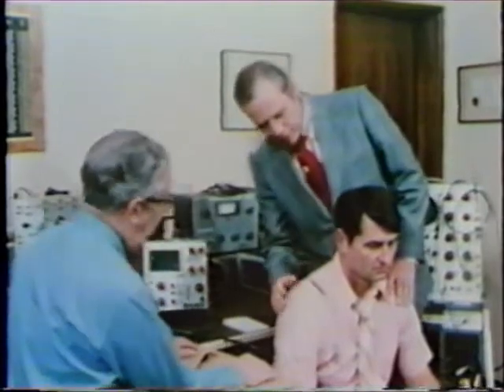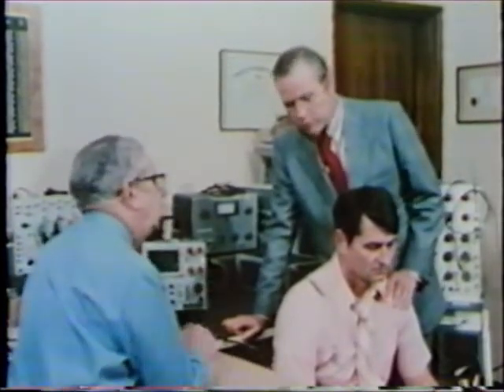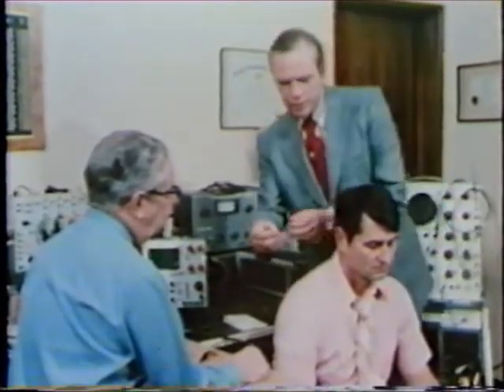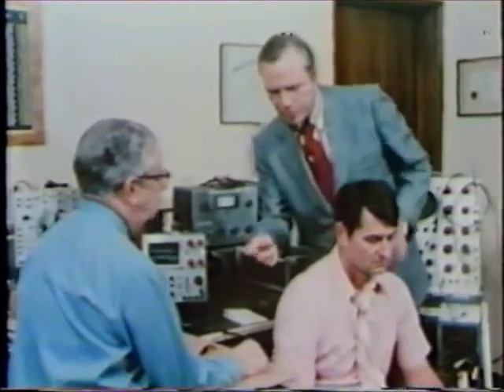Following the healing after the surgical procedure, we began a series of investigations in Jack Urban's laboratory, which were to last over a period of 3 years. Now, the first thing we did was to plug in the electrodes into the button system, and in this way we were able to establish thresholds for pure tone stimuli.